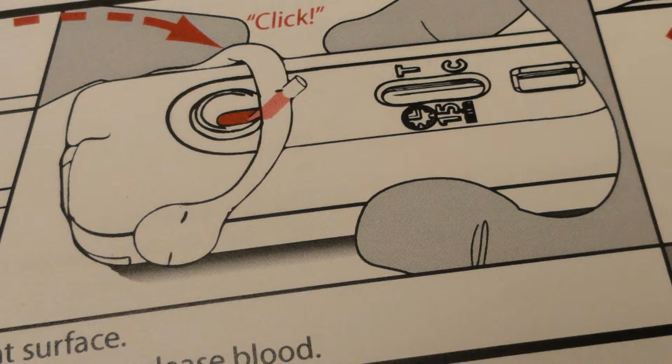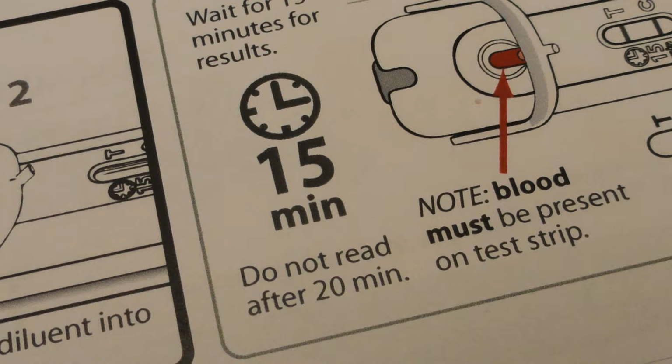And the second negative feedback that we got was around the diameter of the pipette when collecting the blood. And we knew that when we were testing people in cold conditions, that the blood didn't flow as easily as it should have. So then what we did was we went and increased the diameter of the blood collection pipette, and that then allowed for the blood to flow much more easily.